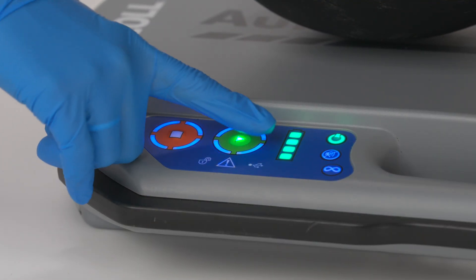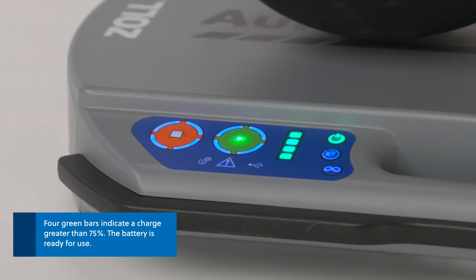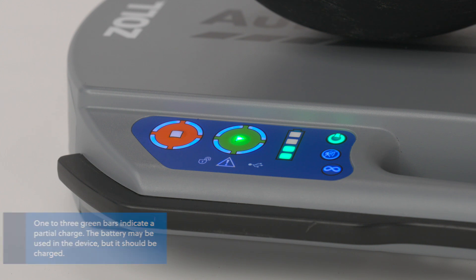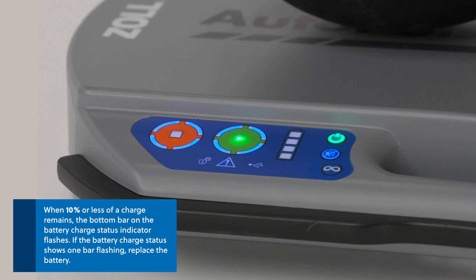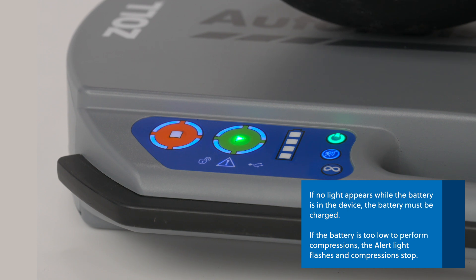The user panel also includes a battery charge status indicator. It features bars that indicate the charge level of the battery in the device. Four green bars indicate a charge greater than 75% — the battery is ready for use. One to three green bars indicate a partial charge; the battery may be used but should be charged. One bar indicates a very low charge — change the battery at the next pulse check. When 10% or less of a charge remains, the bottom bar on the battery charge status indicator flashes. If the battery charge status shows one bar flashing, replace the battery. If no light appears while the battery is in the device, the battery must be charged.